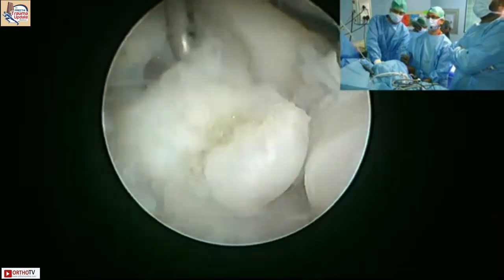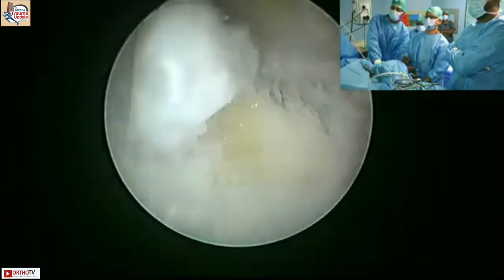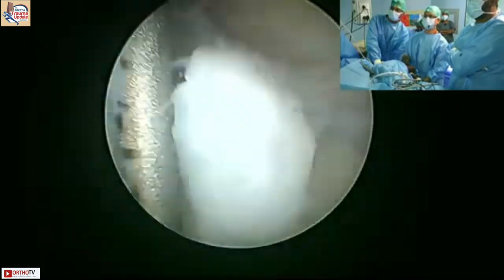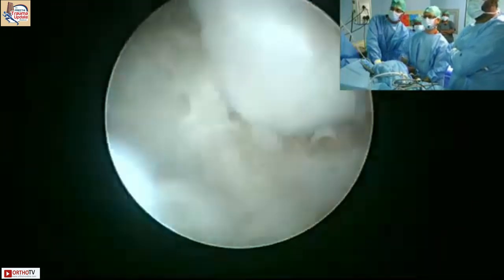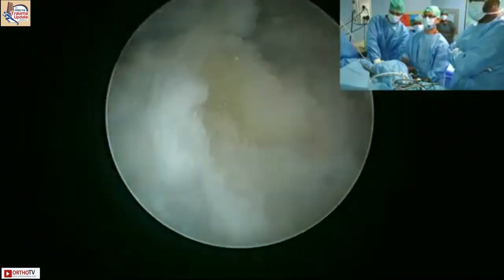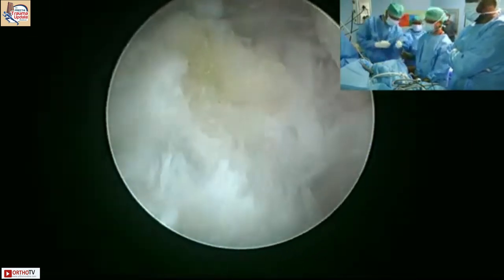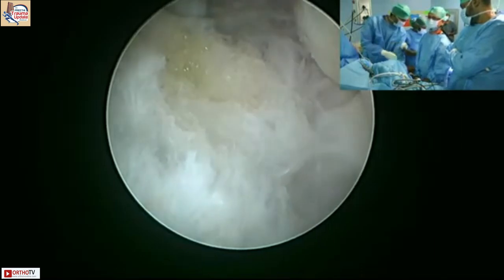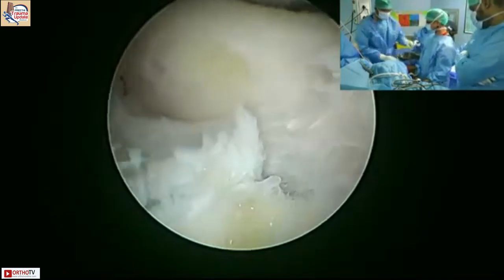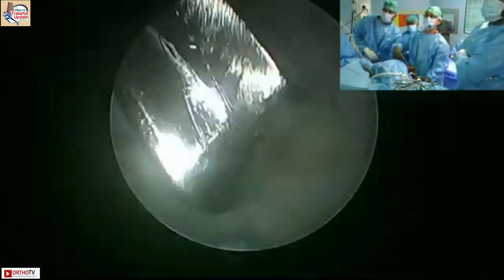So that is your capsule. So now, once I've opened this, my elbow will start swelling. So I have to be quick now. So you want to do posterior? Yes. Let me just give me a grasper, please. No, give me a punch. I'll just punch it out and then shave it off. Because I have taken it piecemeal, it becomes very difficult for me to now take it out with a grasper.